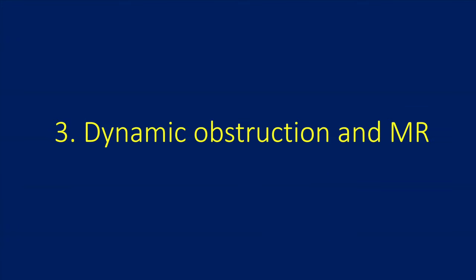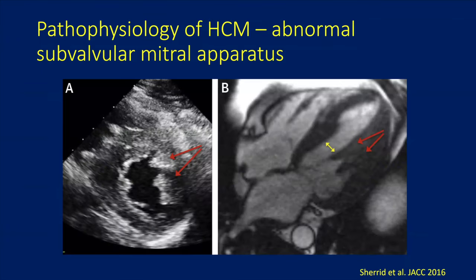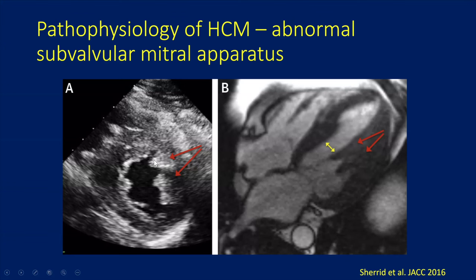Next we're going to spend some time talking about dynamic obstruction and MR. In HCM, there are significant abnormalities in the intrinsic mitral valve as well as the mitral valve apparatus. Here is a short-axis echo at the mitral valve level demonstrating abnormalities of the mitral valve subvalvular apparatus. In HCM, the papillary muscles can often be bifid — having two heads — and can often be anteriorly displaced, meaning they move closer to the ventricular septum. Sometimes there's abnormal insertion directly into the mitral valve. When the papillary muscles are anteriorly displaced, it brings the entire mitral valve apparatus closer to the septum and to the LVOT, increasing the predisposition for LVOT obstruction.